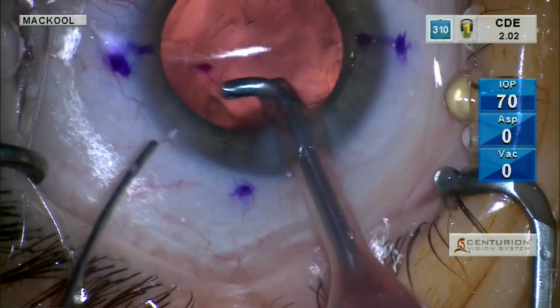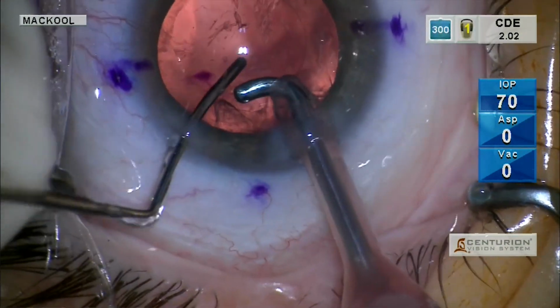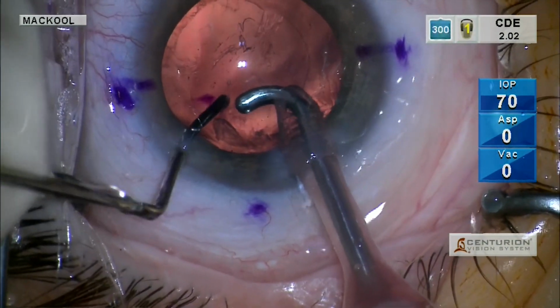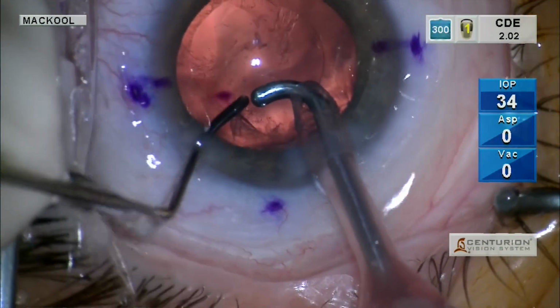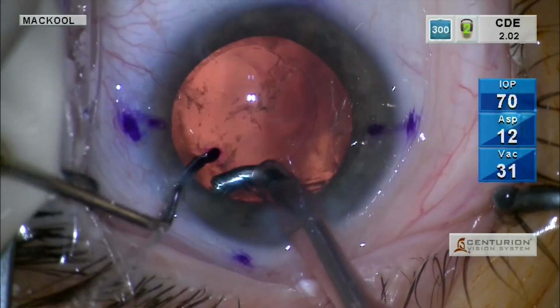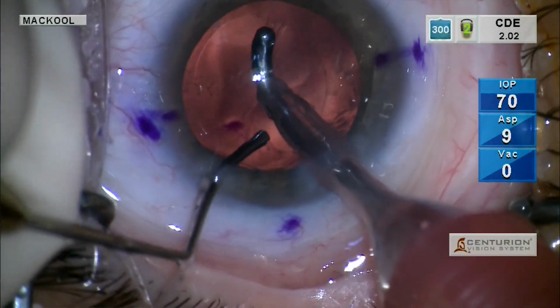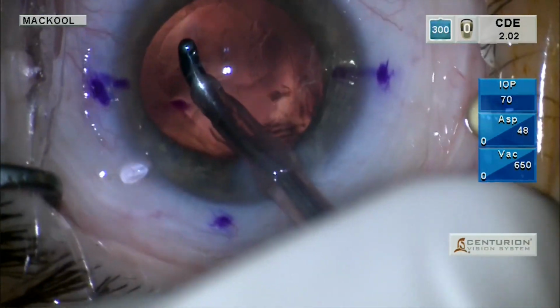Now sometimes, not in this case, and there's that nuclear segment that we just aspirated, wet the cornea. Sometimes the posterior capsule is more forward than others, and that's when you put a spatula there. And again, those of you in 3D can see this. Put the spatula right against the posterior capsule. And now the posterior capsule just can't come up and be aspirated.